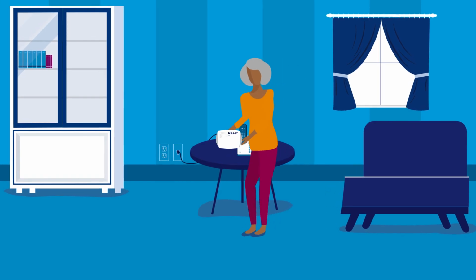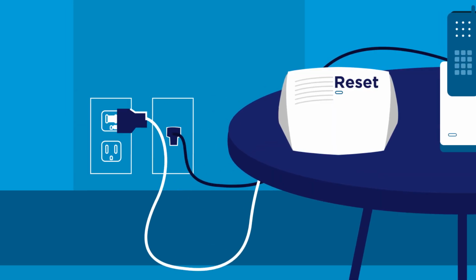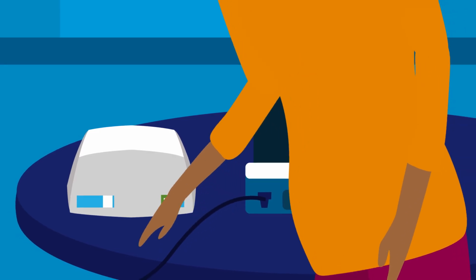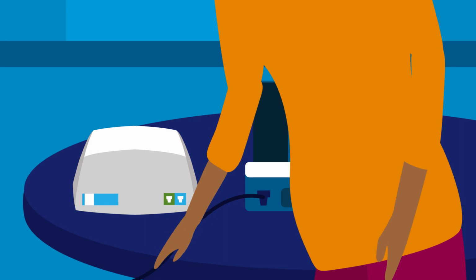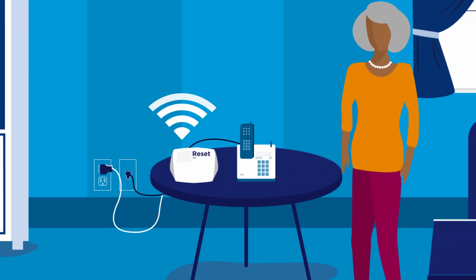Place the home communicator in the room where you spend most of your time. Plug the home communicator's power cord into an electrical outlet. Then, slide the power switch on the back of the home communicator to the on position. The home communicator will say, "Good, we detect power."